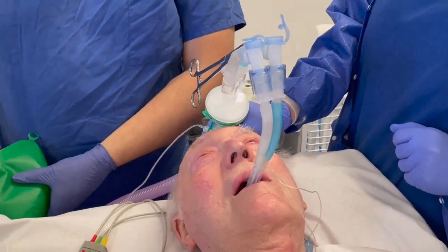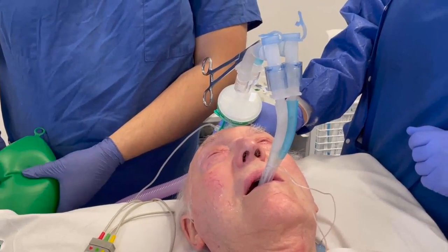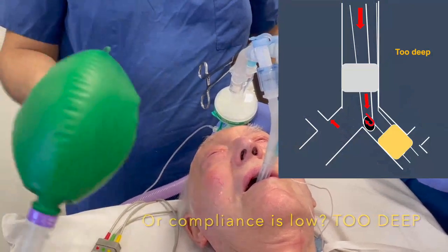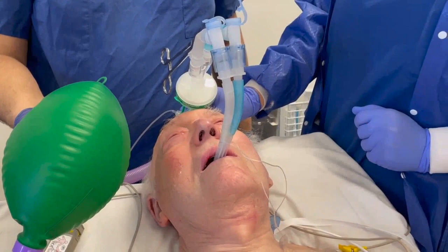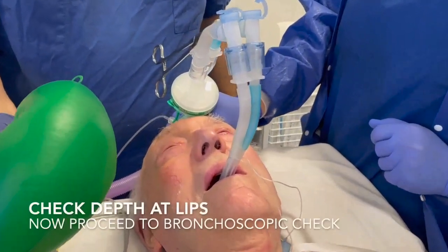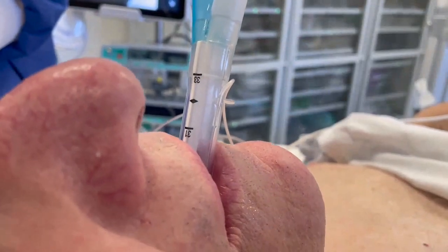Alternatively, if there is resistance to hand ventilation and the right lung does not readily ventilate, the tube is too deep — the tracheal lumen is occluded in the left main bronchus. If so, withdraw the tube slightly after deflating the cuffs until the right lung ventilates, then re-inflate the cuffs. Verify the centimetres at the lips and proceed to the bronchoscopic check.